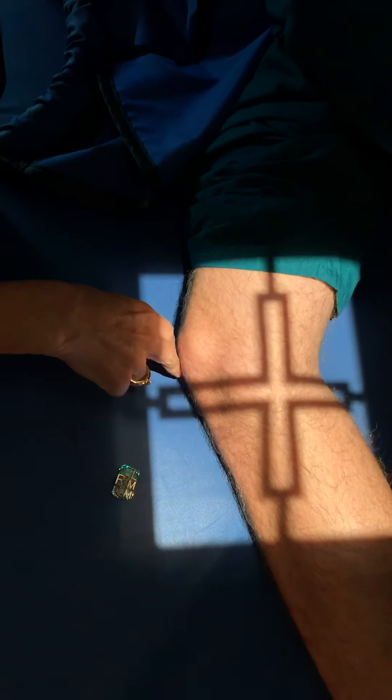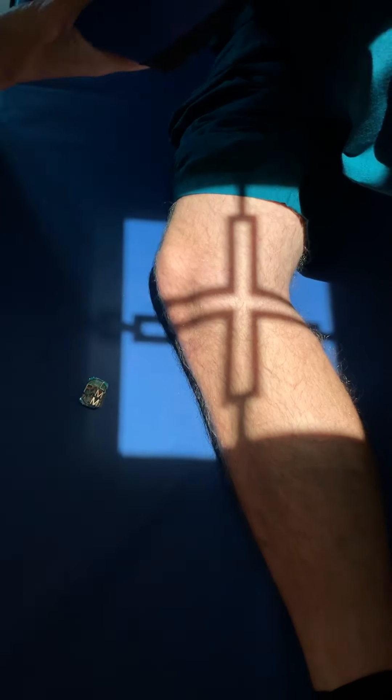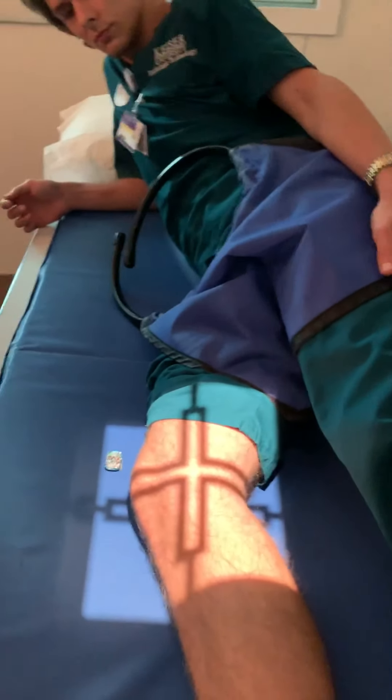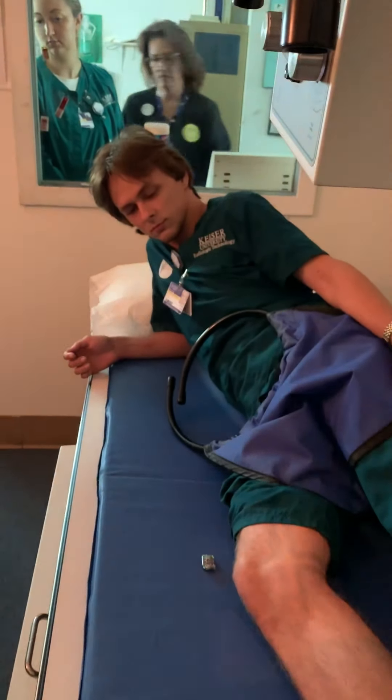The hardest part is watching that knee, keeping him positioned, and shielding all at the same time. Central ray is on the medial epicondyle — right here, coming towards you. I want the middle of the knee, with equal light front and back. Epicondyle here — I like that. Shielded, angled five to seven cephalic, same technique, bucky aligned. Hold still like that for me. Good, you can relax.